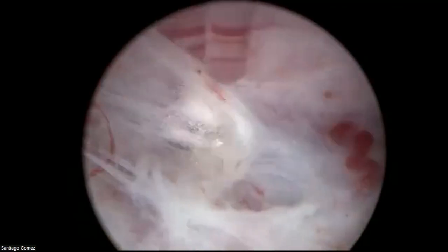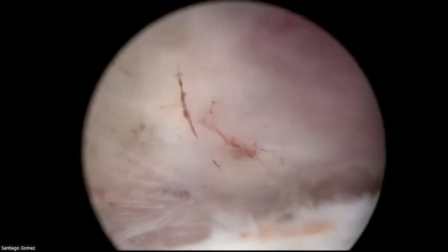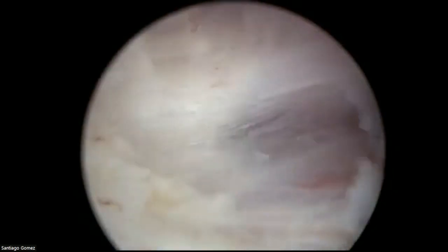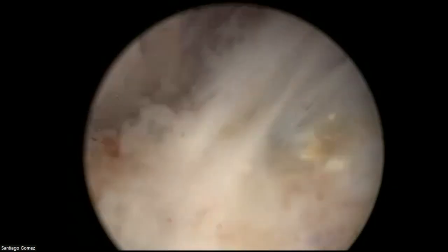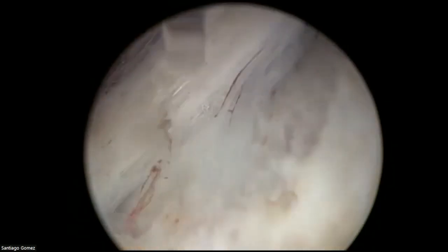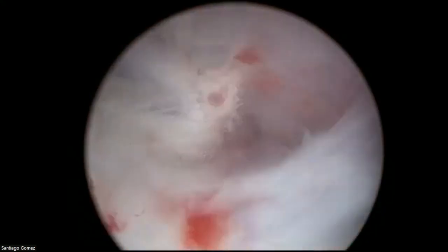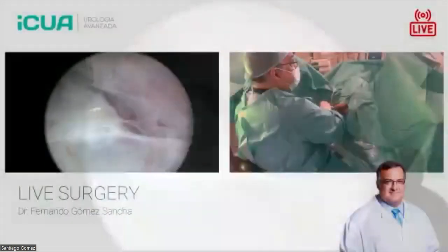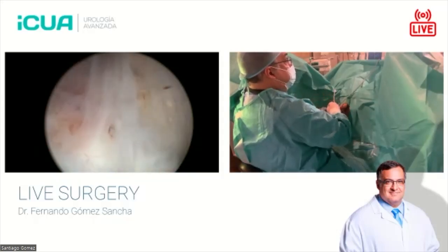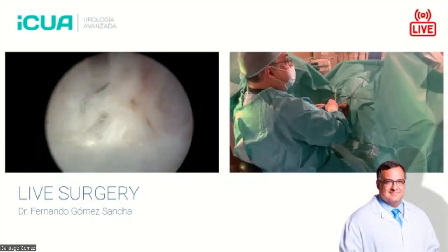And here, what I'm trying to concentrate on is these parameters I told you. I have my settings, but I want to do a nice dissection and at the same time carry a nice hemostasis. If I rush it too much, what's going to happen is that I will dissect the plane very beautifully, but the quality of hemostasis will be a little bit less. So I have to look at a nice tempo, a movement that gives enough time to the energy to provide a nice coagulation. And then I have to check always, and I have to connect the lines always so that we have a nice orientation all the time.